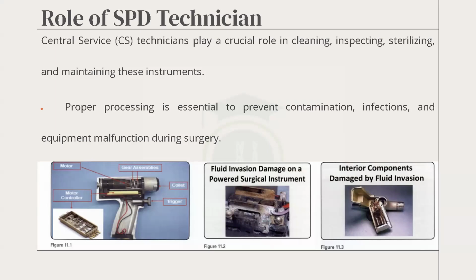Are we able to get it? So simply put, with powered surgical instruments, we should not allow water to go in them. That is why along the line you will see that they are not supposed to be immersed. They are not supposed to be left in the water for long hours or a long period of time. Next slide, Director.